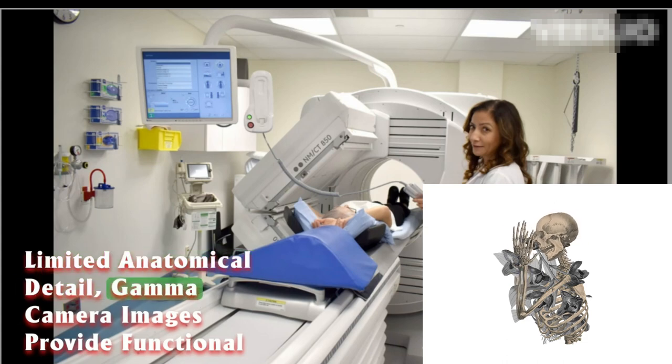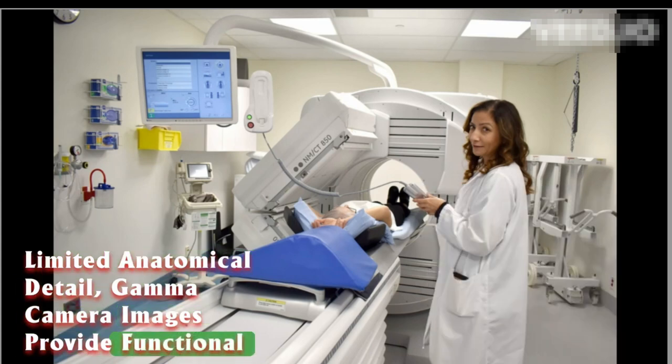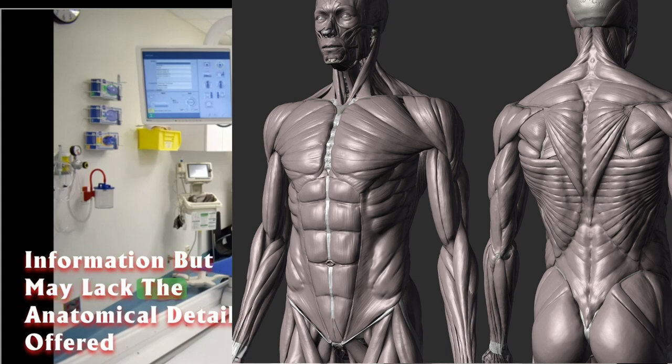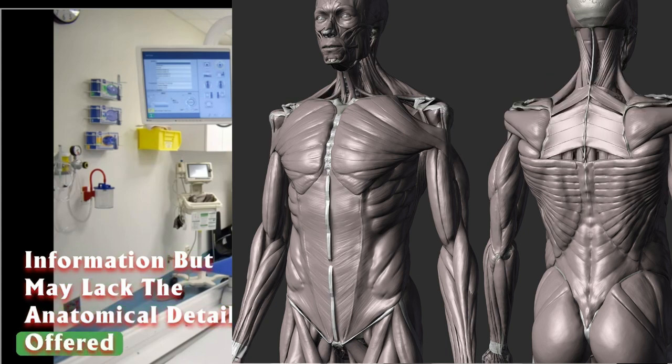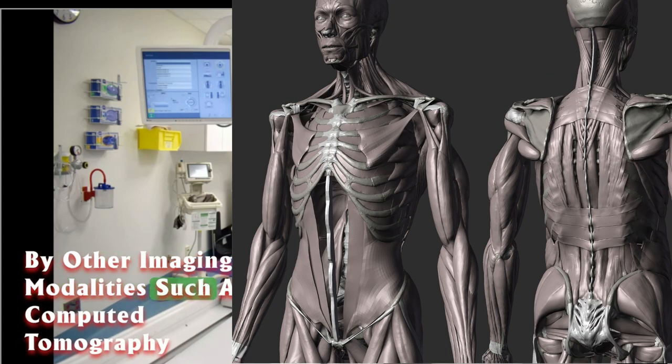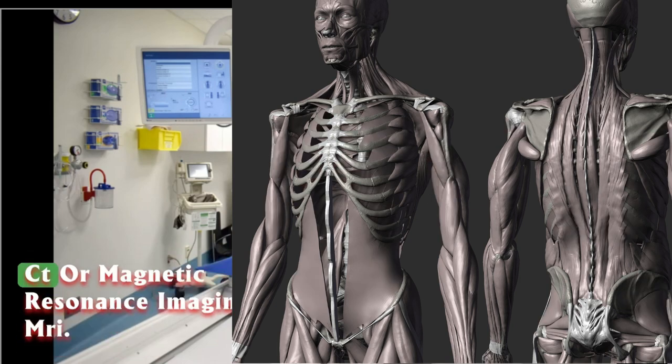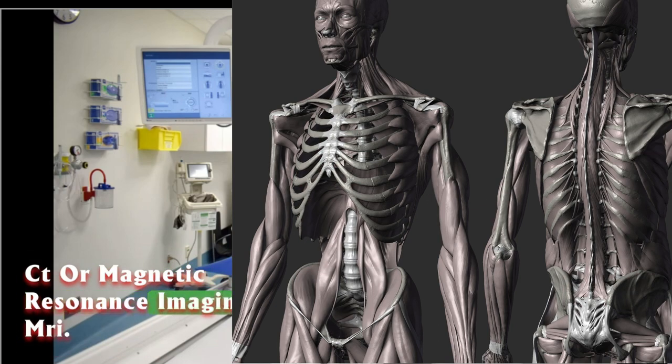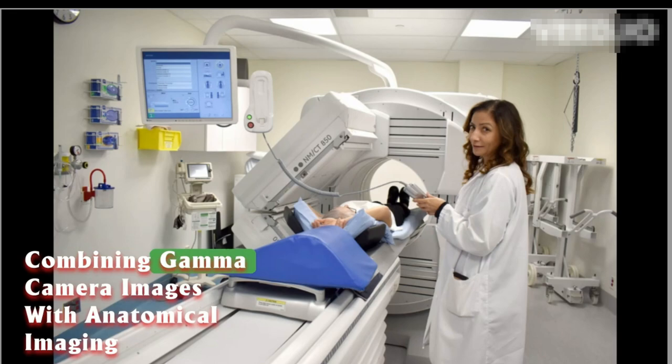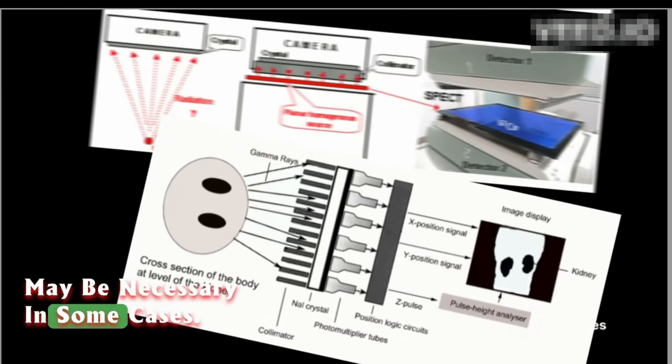Limited anatomical detail: Gamma camera images provide functional information but may lack the anatomical detail offered by other imaging modalities such as computed tomography (CT) or magnetic resonance imaging (MRI). Combining gamma camera images with anatomical imaging may be necessary in some cases.